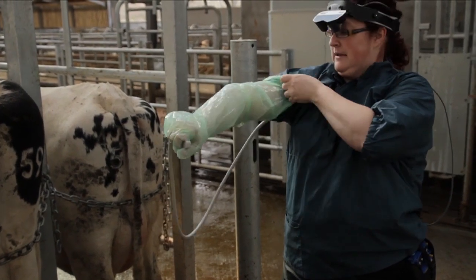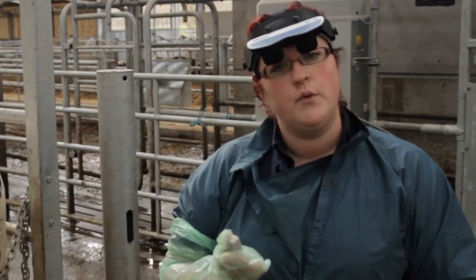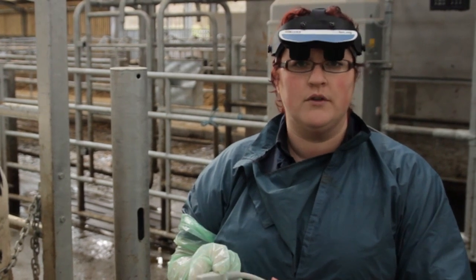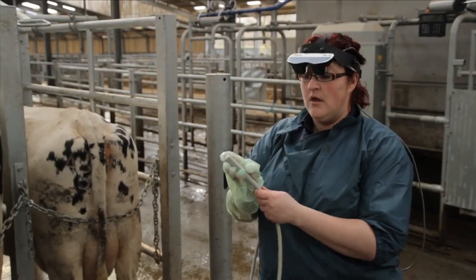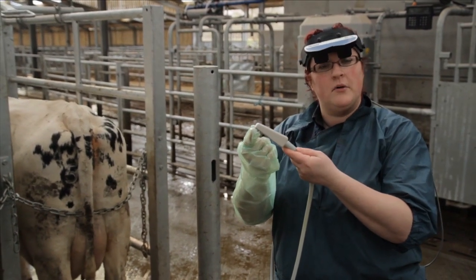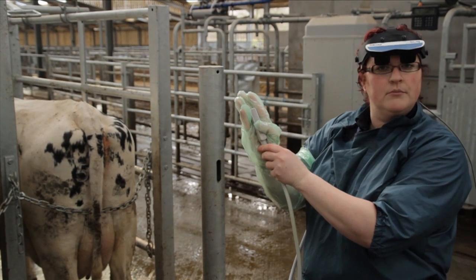I will be scanning right-handed today. We'll just have a quick recap on how to hold the probe and the movements that we can make once we're inside the cow. So firstly, we need to remember this is our leading edge, which corresponds to the left-hand side of our screen. We need to palm the probe.